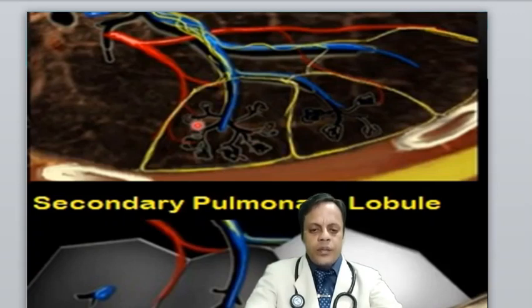You cannot see across this. This will become totally opaque. This is transparent, this is opaque. So here this is the primary, secondary pulmonary lobule. At the peripheral region, you can see perilymphatic areas, and in the center you will always find a terminal bronchiole with alveoli and a pulmonary artery always adjacent to it. Let us move further. We are also going to teach you a little bit about the pathophysiology and the pathology.